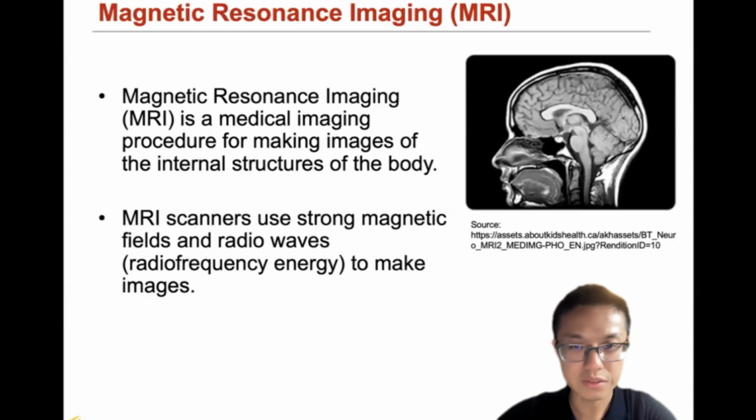Next we have a short video just trying to demonstrate what the procedure of doing an MRI is, and the basic principle of MRI to generate the images.